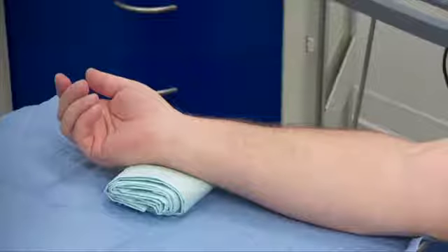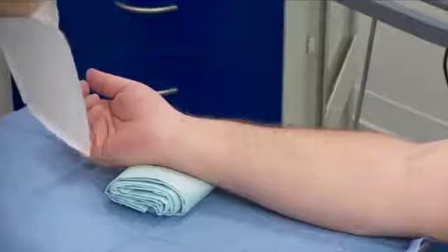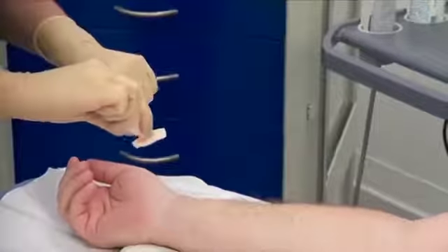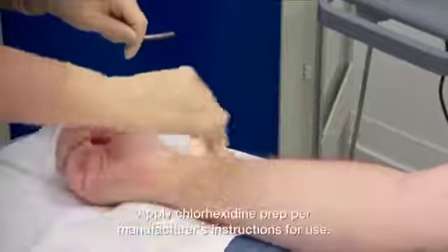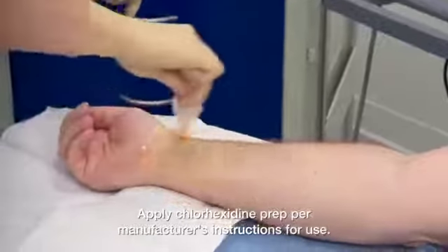Next, you will want to prepare the extremity for insertion. Position the wrist in dorsiflexion to bring the artery in closer proximity to the skin. Prep and drape the insertion site per hospital protocol. As part of any CLABSI prevention bundle, use a chlorhexidine-based skin prep as recommended by the CDC guidelines. Use a scrubbing motion to create friction. Be sure to prep and allow the proper drying time per manufacturer's instructions for use.